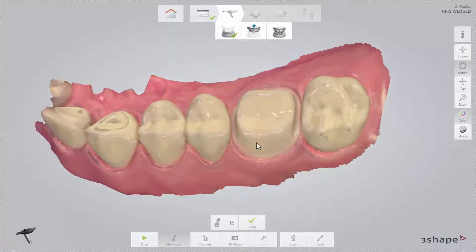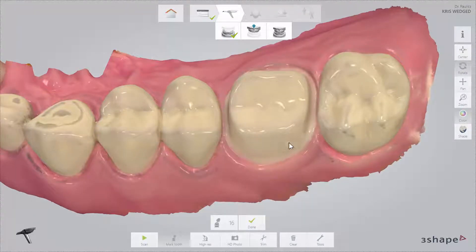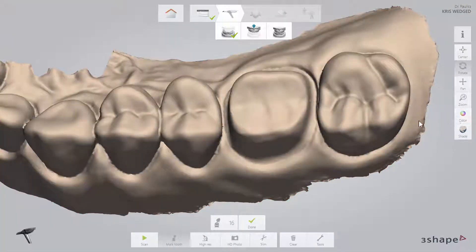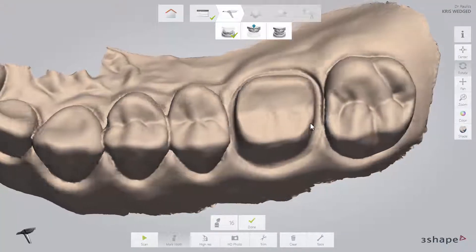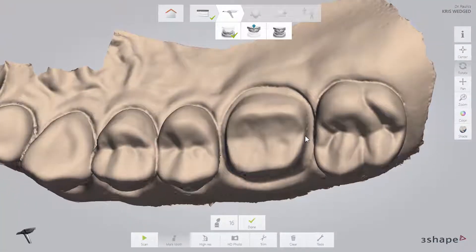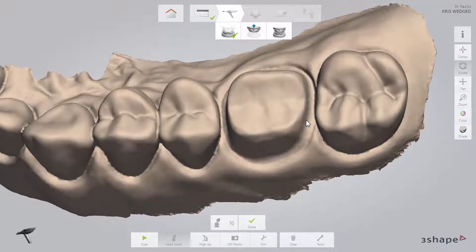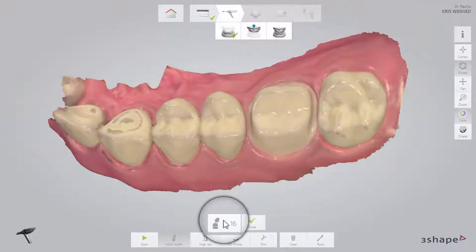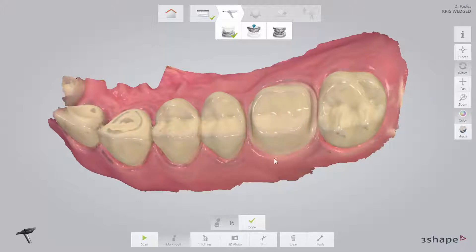Verify this by zooming in on the preparation, turning off colours, and rotating the preparation. Finally, mark the preparation using the Mark Tooth button. Once you have marked the tooth, the software will automatically check if there are any areas near the preparation that have not been scanned.